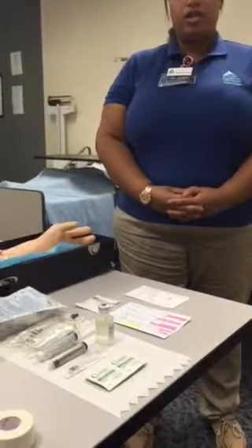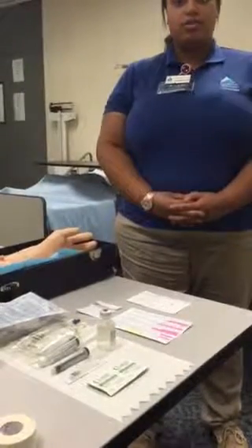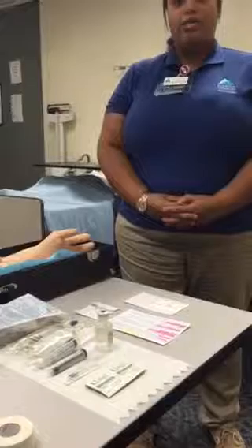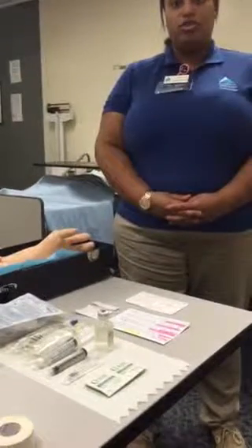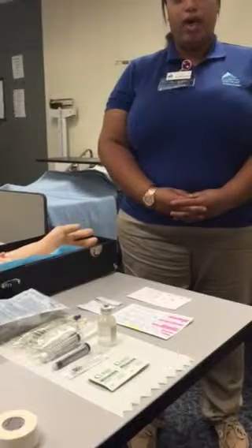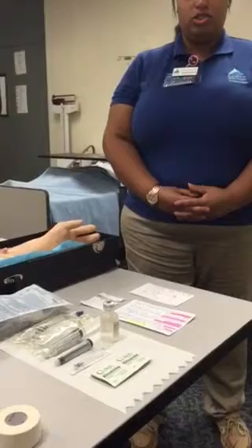Today I'm going to be demonstrating IV administration via minibag. The first thing I would need to do is implement my standard protocols. I would be checking my MD orders, making sure that the correct medication, the dose, the frequency, and the route is all correct for my patient.